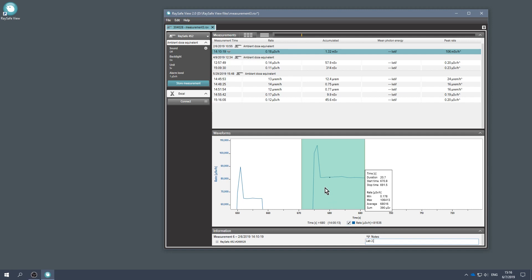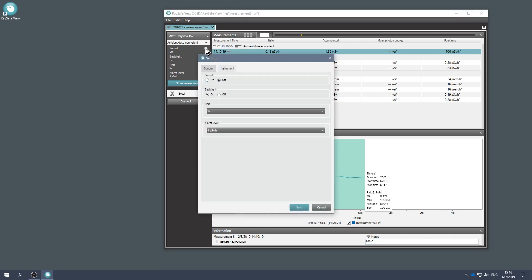You can change the instrument settings from RaySafe View. Press the cogwheel to access the instrument settings. Let's change the dose unit.